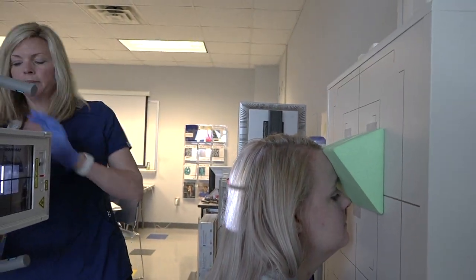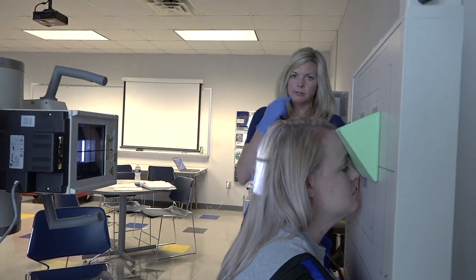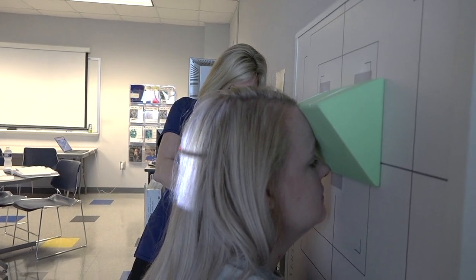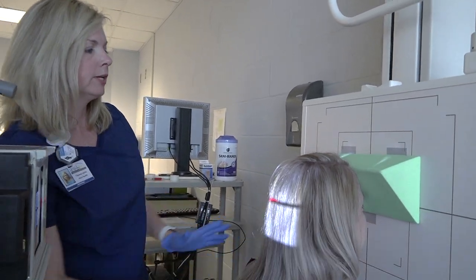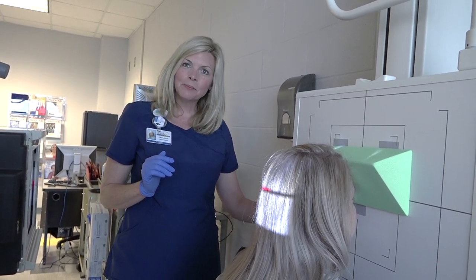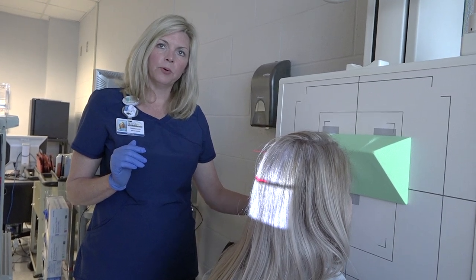So the centering with the PA is at the nasion. The nasion is again at the bridge of the nose, and that's where we are. We'll make sure that we're lined up and there's no rotation or tilt. So the anatomy demonstrated with the PA is the frontal and the ethmoid.